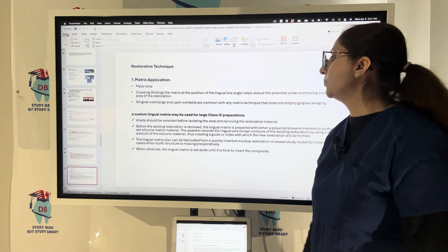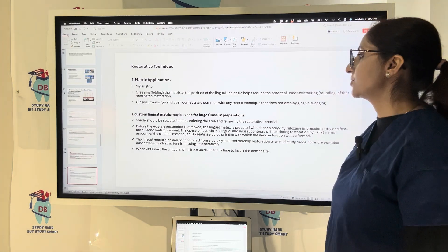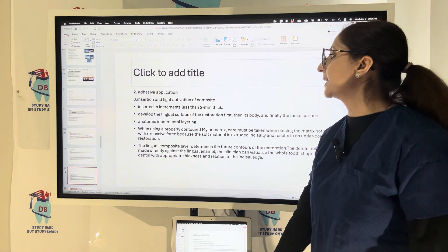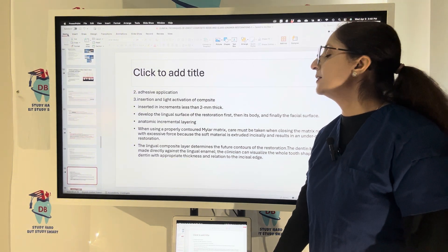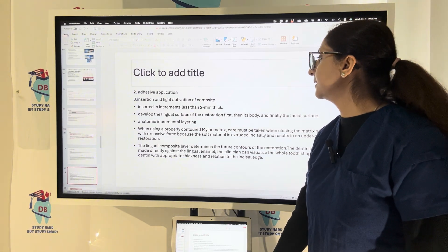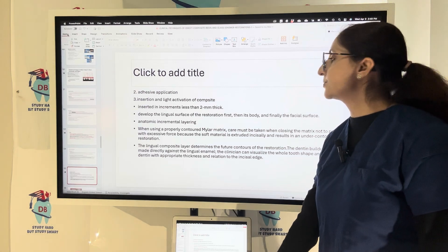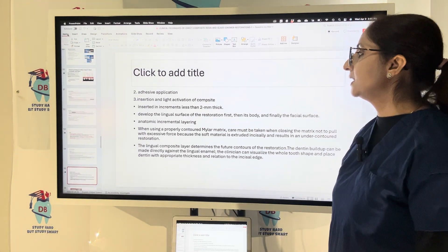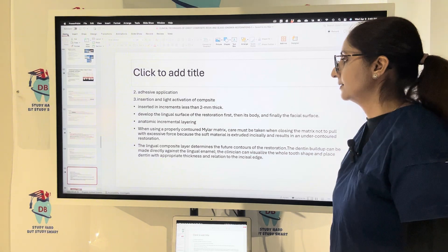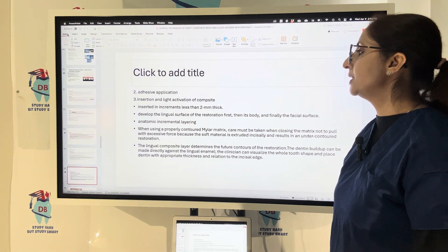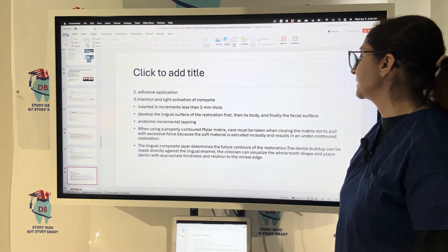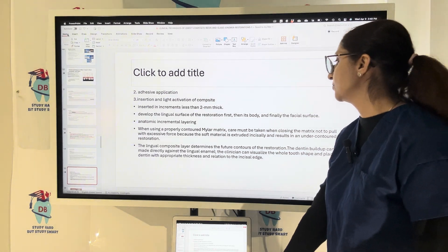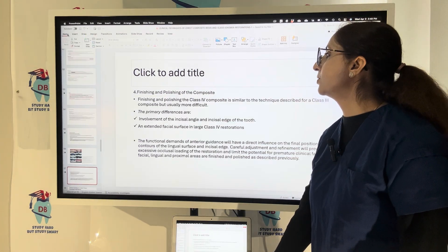A custom lingual matrix can be used for large Class 4 preparations. Apply the adhesive, insert and light-activate the composite. Increments should be less than 2 mm thick. Develop the lingual surface of the restoration first, then the body, and finally the facial surface — anatomic incremental layering is desired. When using a properly contoured mylar matrix, care must be taken not to pull with excessive force when closing. Finally, finish and polish the composite.